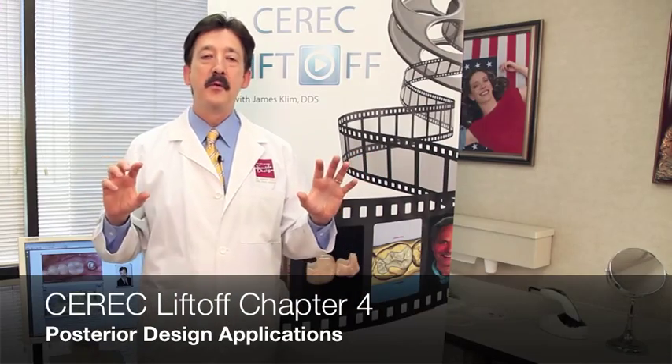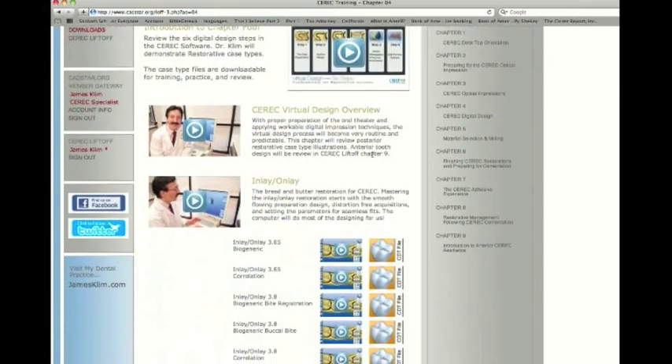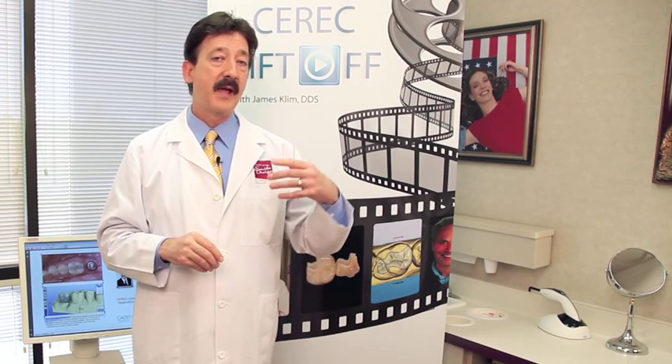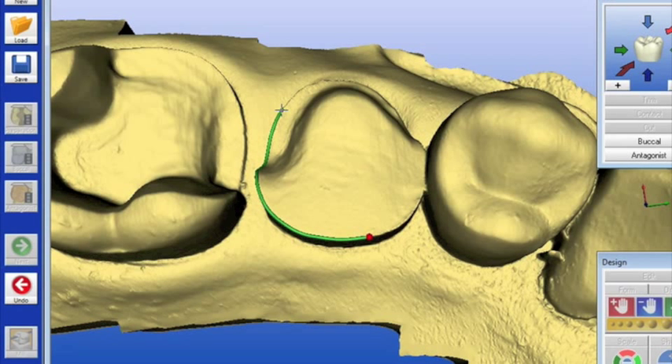Chapter four is our design chapter — it's devoted to your teeth. What's neat about this chapter is that I divide it up into different types of design techniques. For instance, we have partial coverage techniques, full crown techniques, and quadrant techniques.